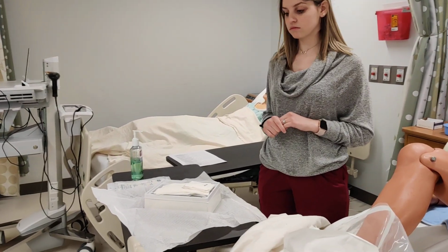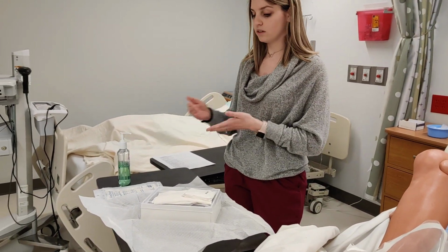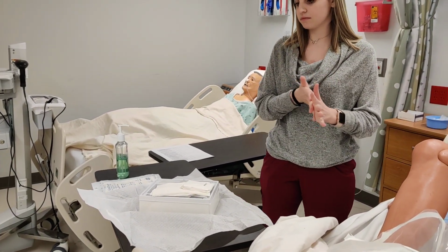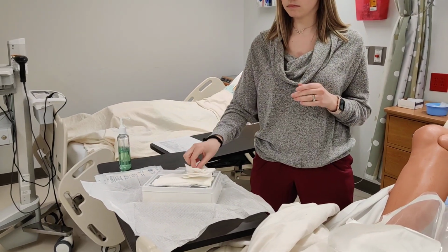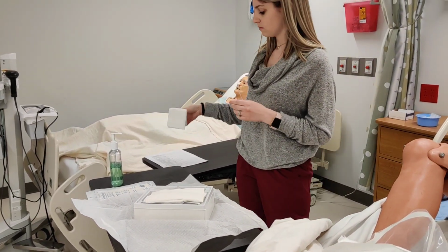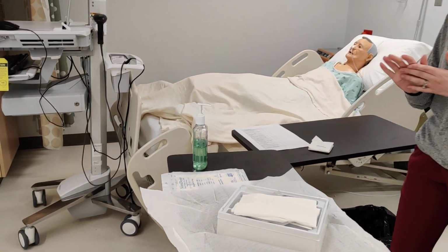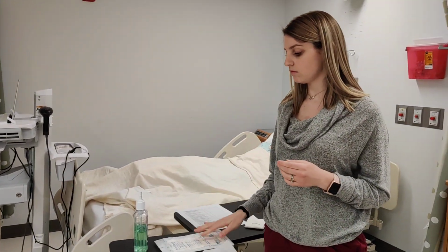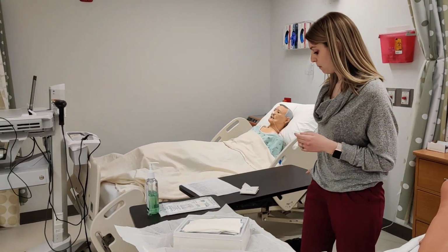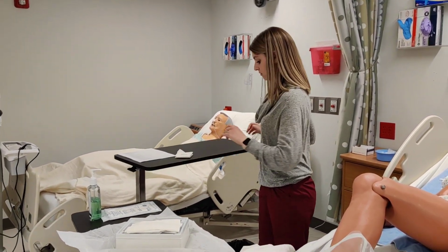So Gabby's going to keep moving forward with this skill. Once her sterile field is open, she is going to take out her sterile gloves. That top package, you can reach in and just grab those sterile gloves out without touching anything else. Notice that on her table, she does have an extra pair of sterile gloves that she brought with her. It's important to have some extra supplies just in case you contaminate the sterile gloves that were in the kit.